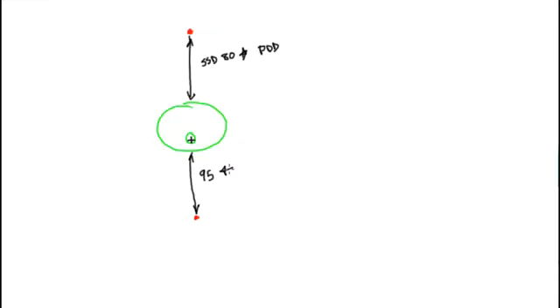But the problem is, from our discussion before, you know that at 95 SSD, the PDD is going to change because that PDD is dependent on what the SSD is. So this is not a very convenient situation for doing an isocentric treatment because you can't just look these up in a table. So the solution is to not use the PDD at all, but instead use another quantity called the TMR, the tissue to maximum ratio. And I'm going to walk through what that is now.